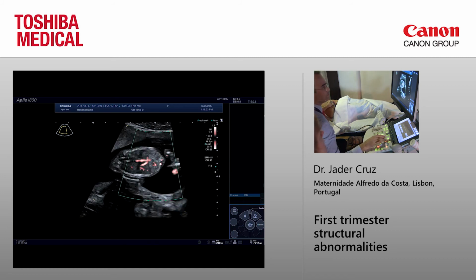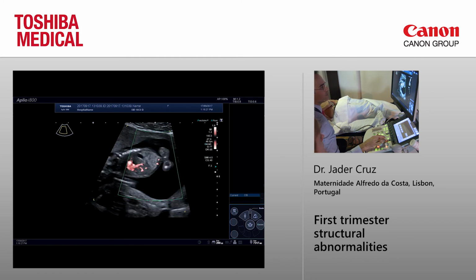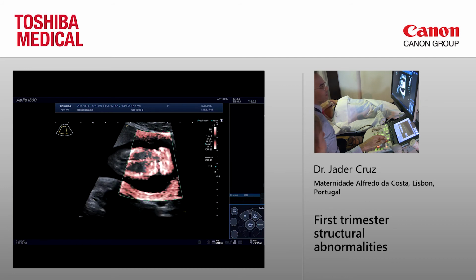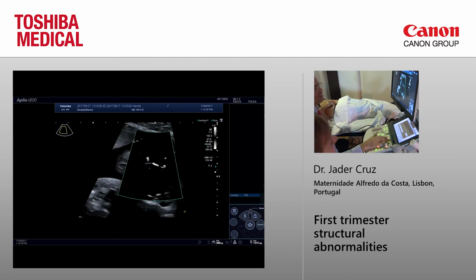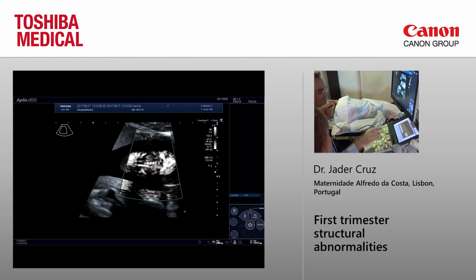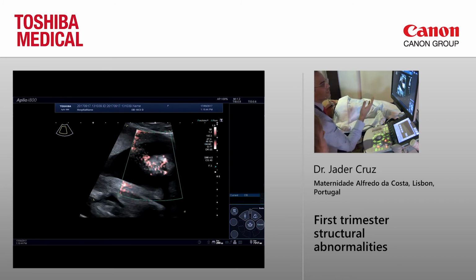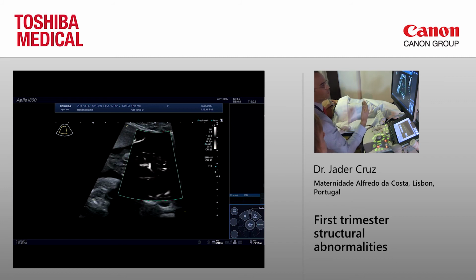You have this also, this is also SMI. This is called color chrome SMI, color SMI. I don't like this very much. I prefer the other one. Yeah, I prefer this one better. But that's simple. If you want to show together with the structure, it is nice. The thing I like in the SMI is actually the subtraction mode.